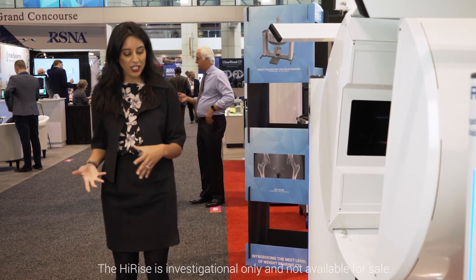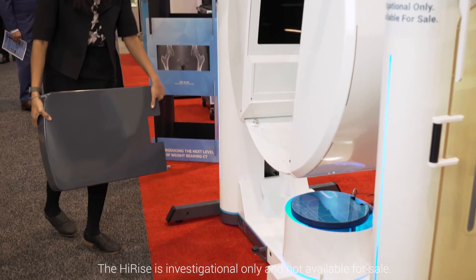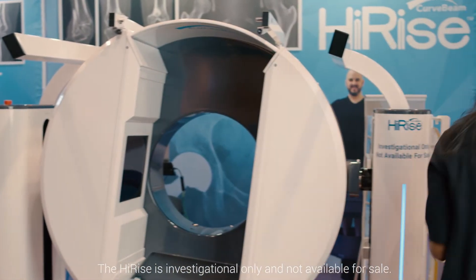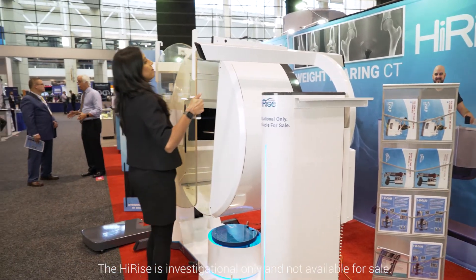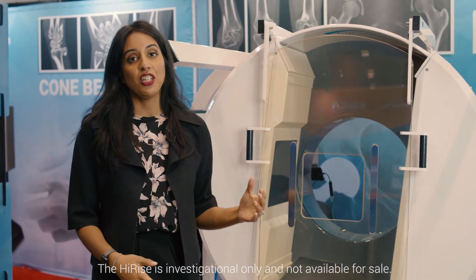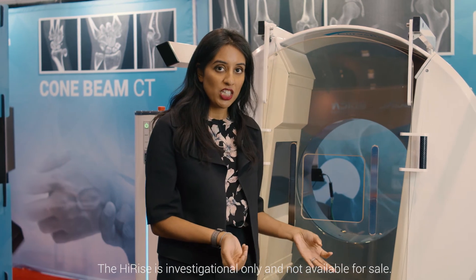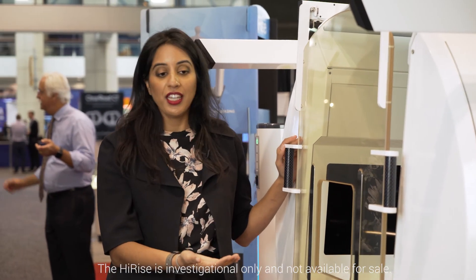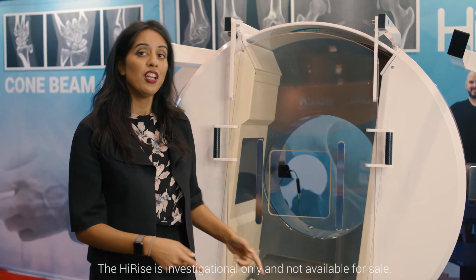To set up for an upper extremity scan, you remove the patient platform and bring over a protective shield. This shield protects the patient from radiation. Normally a platform would be positioned here for the patient to rest their upper extremity on, and then they simply place their upper extremity into the gantry for the scan, which makes a full revolution around their anatomy.